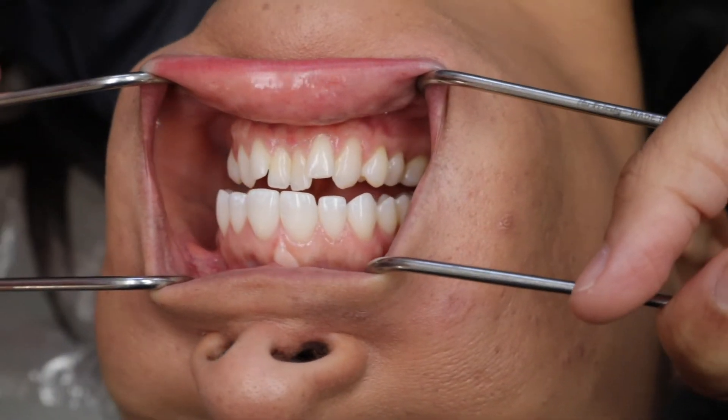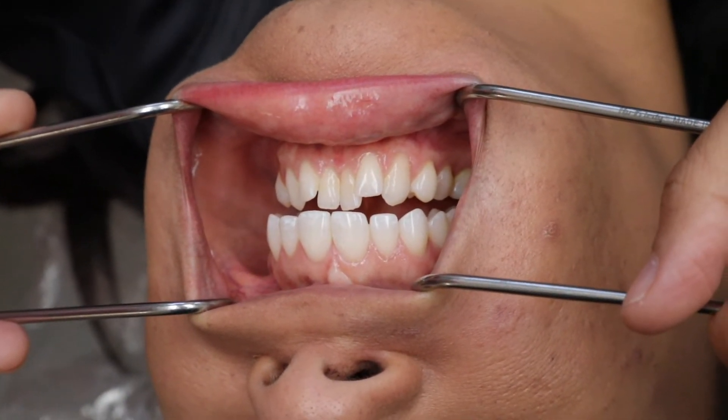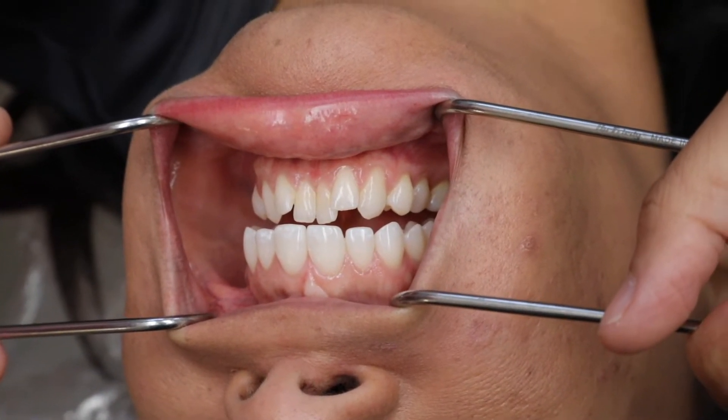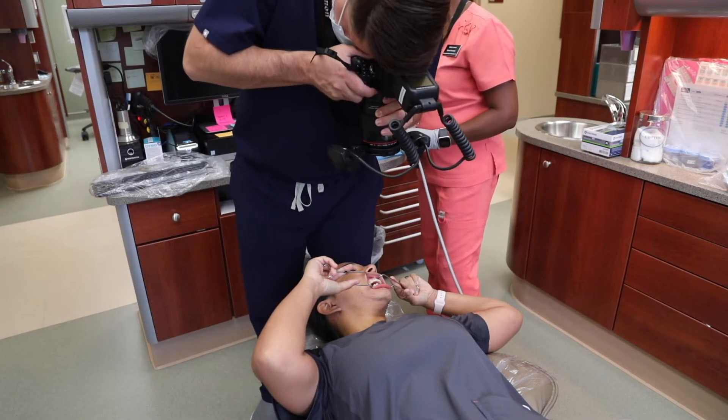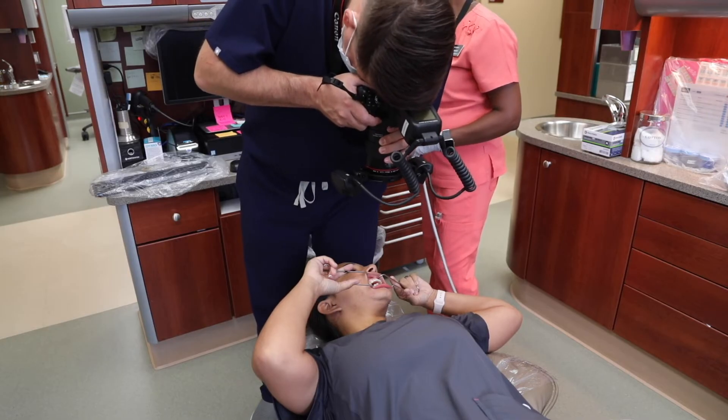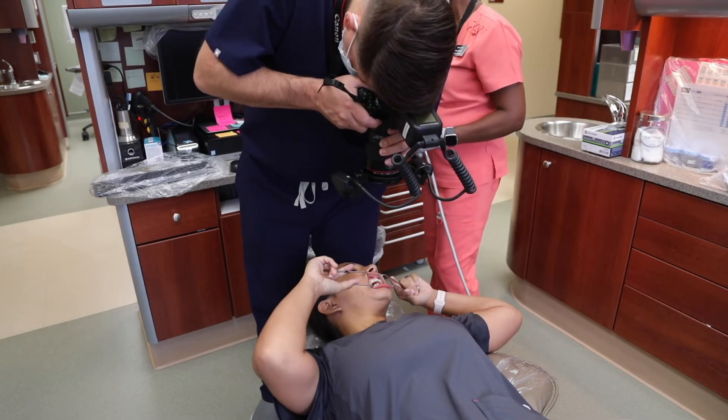Starting with the same position as the retracted teeth apart image, have your patient turn their head 45 degrees left and right for these two photographs. With the teeth slightly apart, have your camera pointed directly at the lateral incisor.